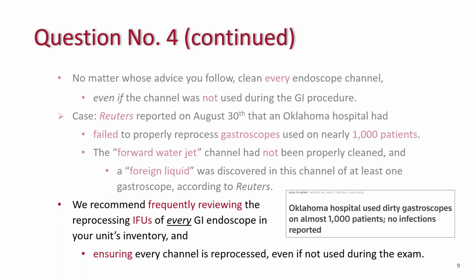Thank you, Ron. And one thing I would add before we move to the next slide, and thank you for all your attention to this and your interest, is that antibiotic-resistant bacteria is narrowing your margin of safety. It's limiting the ability to make an error and get away with it. In the past, we could make mistakes, and the bacteria were susceptible. They're no longer susceptible. So the importance of very aggressive and robust quality control and management measures to assure proper reprocessing is more crucial today than ever.